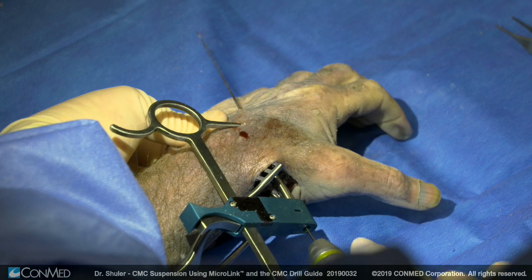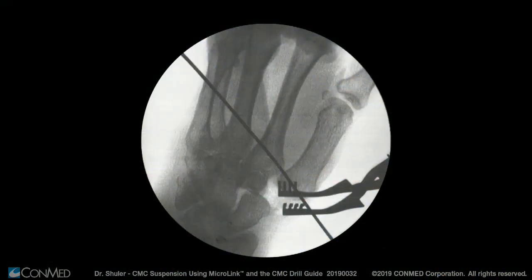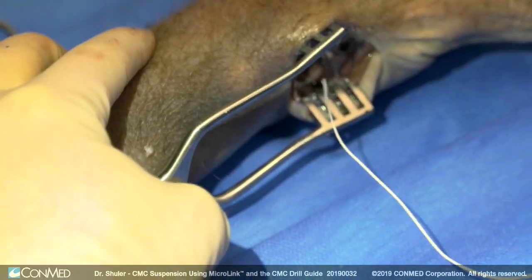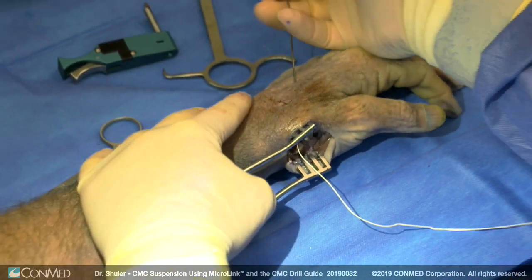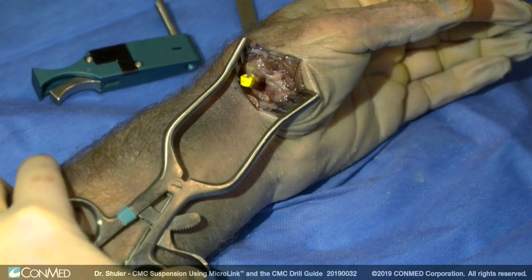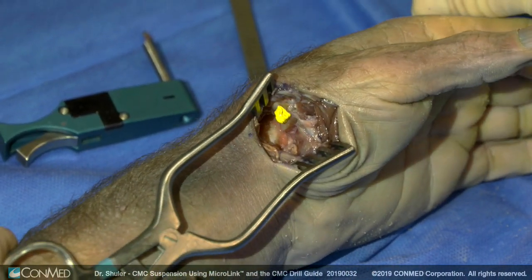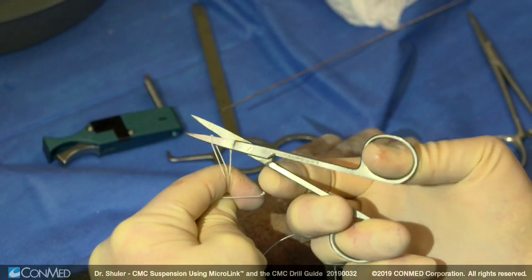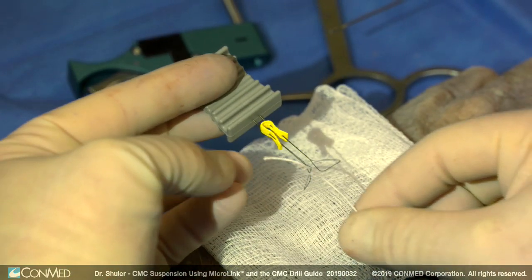Care is taken to place the initial drill hole on the corner of the thumb metacarpal, as placement more distally on the shaft of the metacarpal may prevent thumb abduction. The spliced end of the suture bridge is placed through the nitinol loop, with approximately one to two centimeters of length passed through. The drill bit is then pulled out dorsally through the dorsal aspect of the hand, resulting in the suture bridge being pulled tight against the thumb metacarpal.